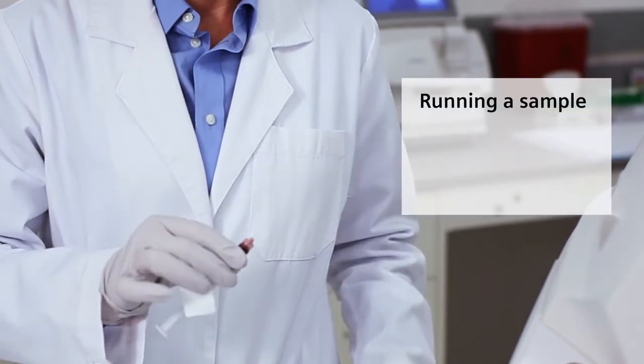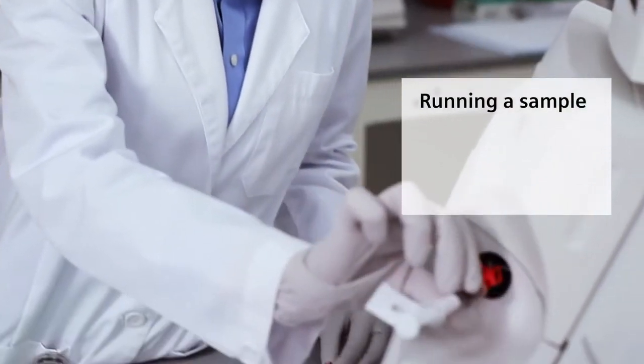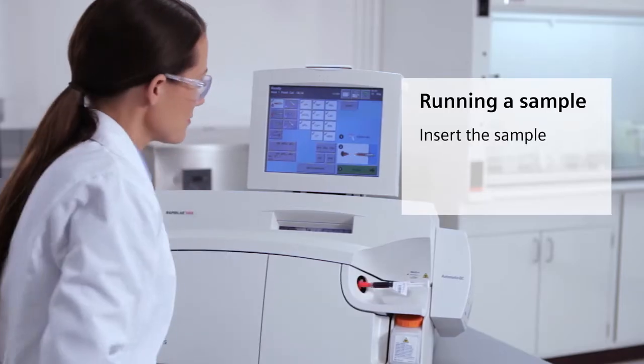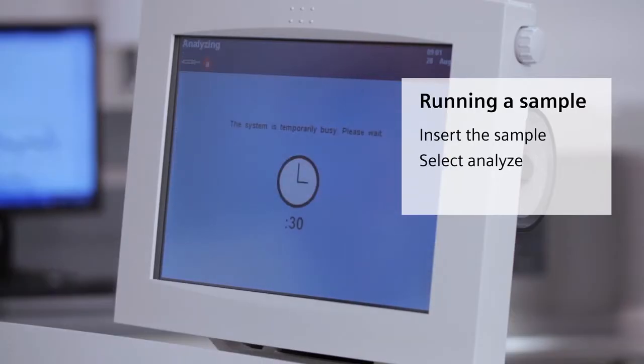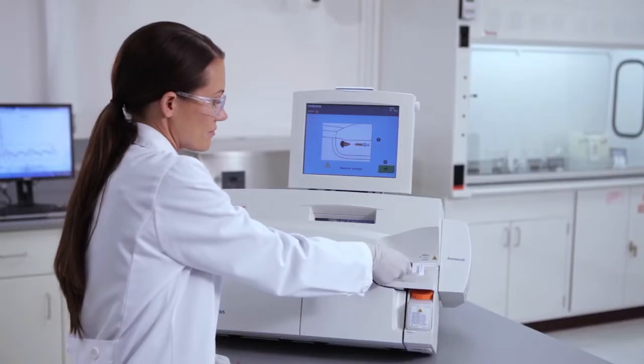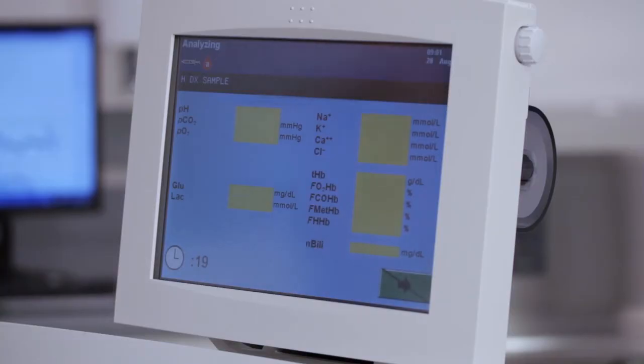Running a sample on the RapidLab 1200 system is easy. Simply insert your sample, select Analyze, and remove the sample. In three steps and just 60 seconds later, the patient's sample is analyzed and results are available.